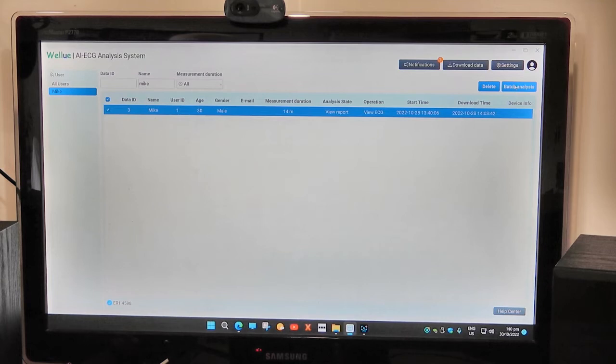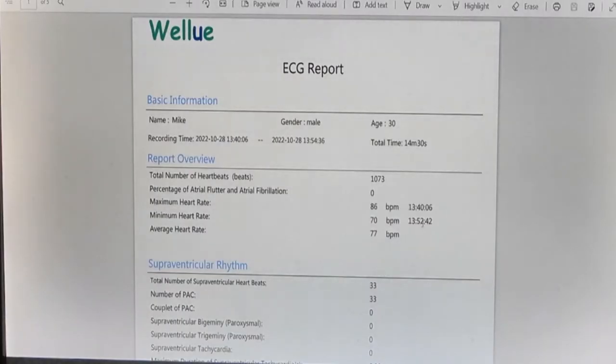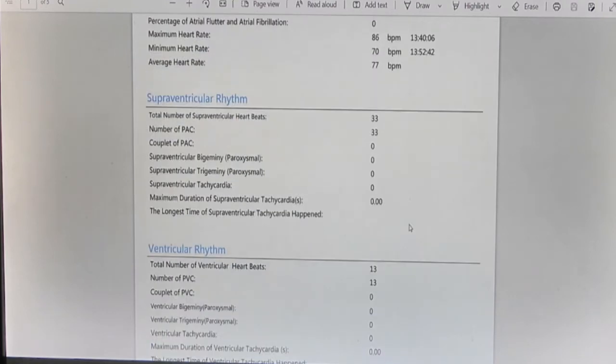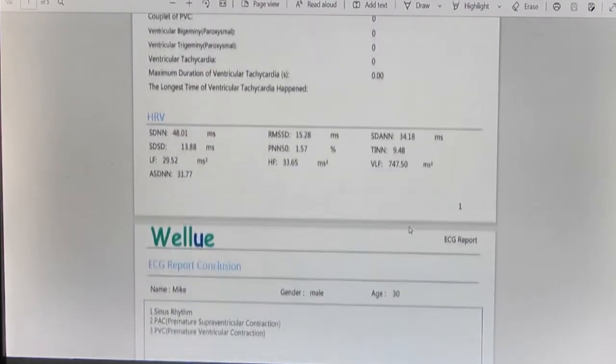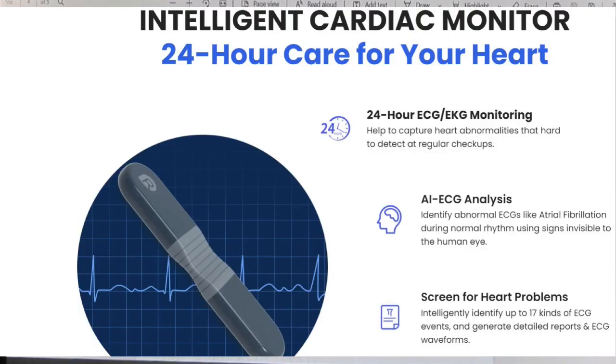The next thing to do is go to batch analysis. It sends your information to the website, and after between 5 and 30 minutes the notification light comes on. You go to notifications, and this is what you get. Then you look at 'view report' and you now have a complete written report of all the tests and measurements you've made.